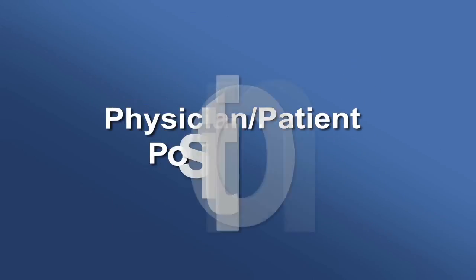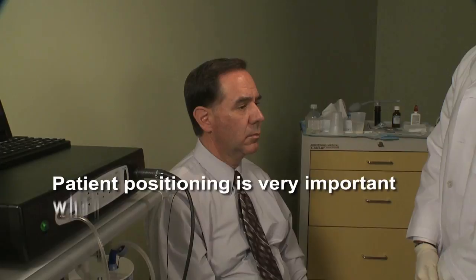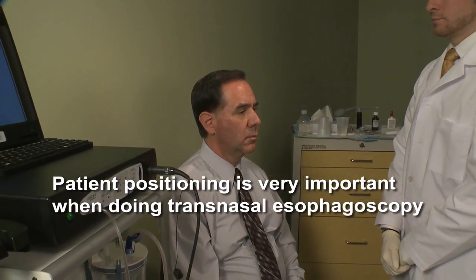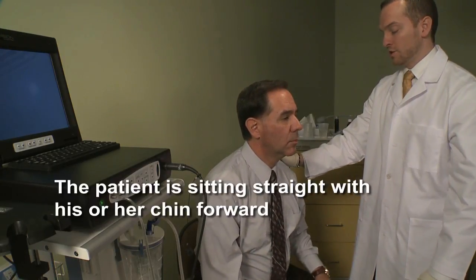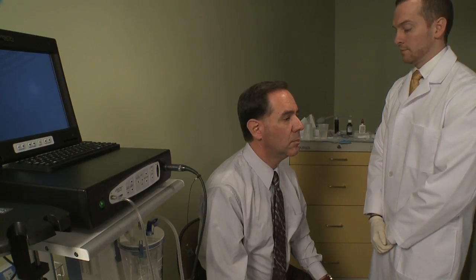Physician-patient positioning. Improper positioning may lead to patient discomfort and difficulty passing the endoscope. Typically, the patient is sitting upright with his or her chin forward. The patient may want to place their hands on their knees to help maintain positioning.